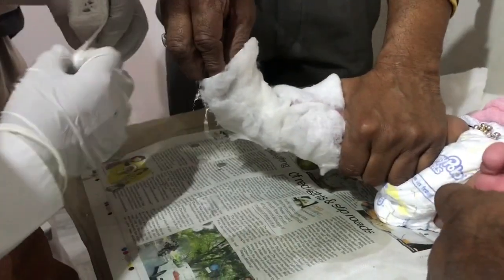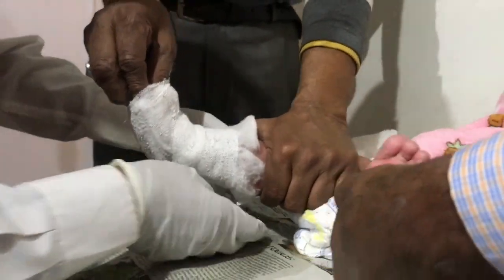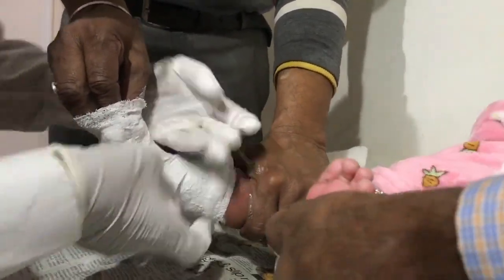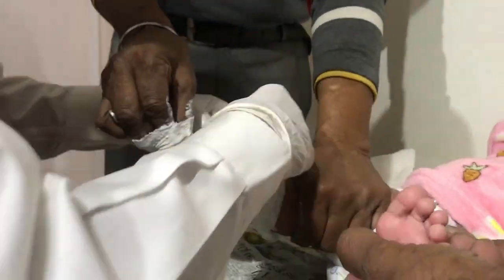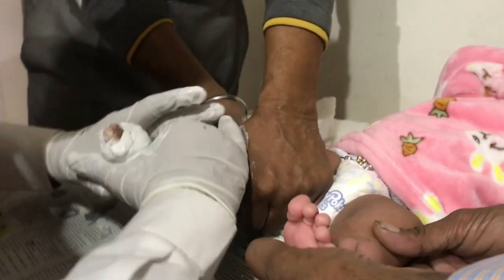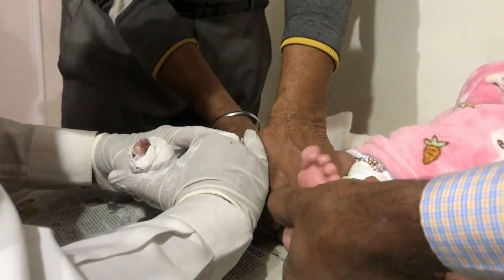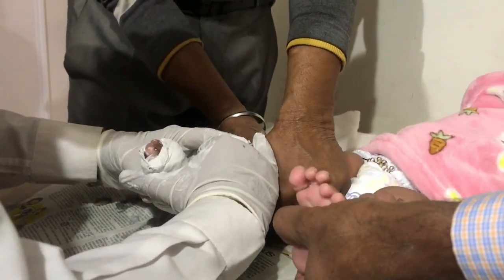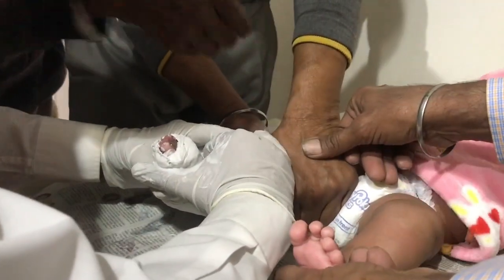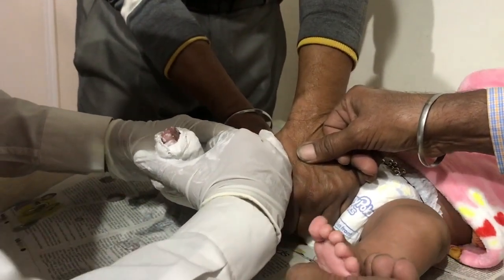Now we will start with the right foot deformity. First part: an assistant holds the condylar part of the internally rotated and extended thigh with the left hand, with the straight thumb along the lateral side over the fibular head to prevent constriction of the cast there, and holds the toes with the right hand from the great toe side, straightening the foot. Adequate cotton padding is applied over the foot and leg, covering the toes. Wet three- to four-inch bandages are wrapped around the foot and leg, remaining about one inch distal to the flexion crease of the knee behind.